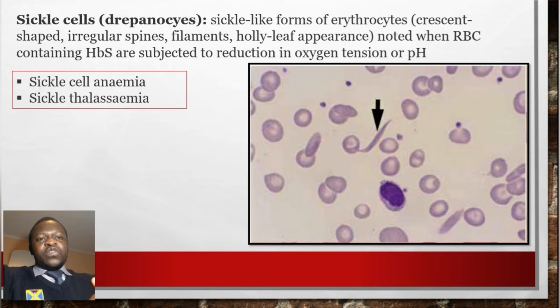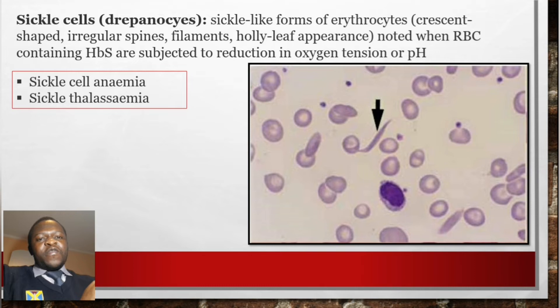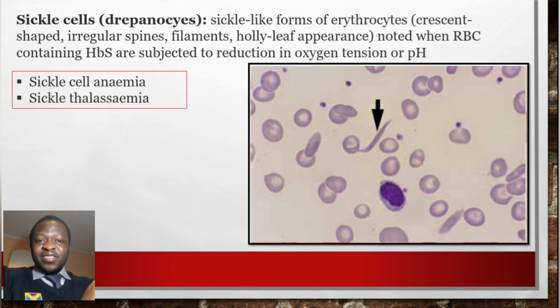Sickle cells are crescent-shaped erythrocytes with irregular spines and filaments, showing a holly-leaf appearance. They are seen when erythrocytes containing HbS are subjected to a reduction in oxygen tension or pH. Sickle cells are found in sickle cell anemia and sickle-beta thalassemia.